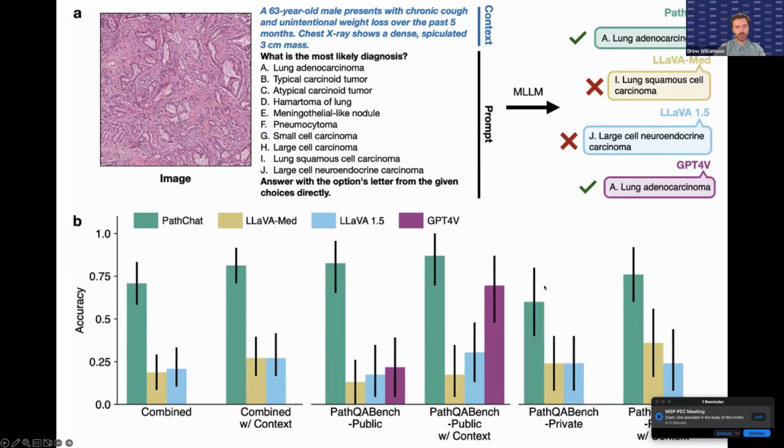And so we also have some open-ended version of this, which was difficult to evaluate. I had to get some other pathologists to read the open-ended responses to questions where maybe we didn't provide it with answer choices, just said, what's the most likely diagnosis? Or we ask it, what molecular alterations would you expect in this image, et cetera, et cetera.